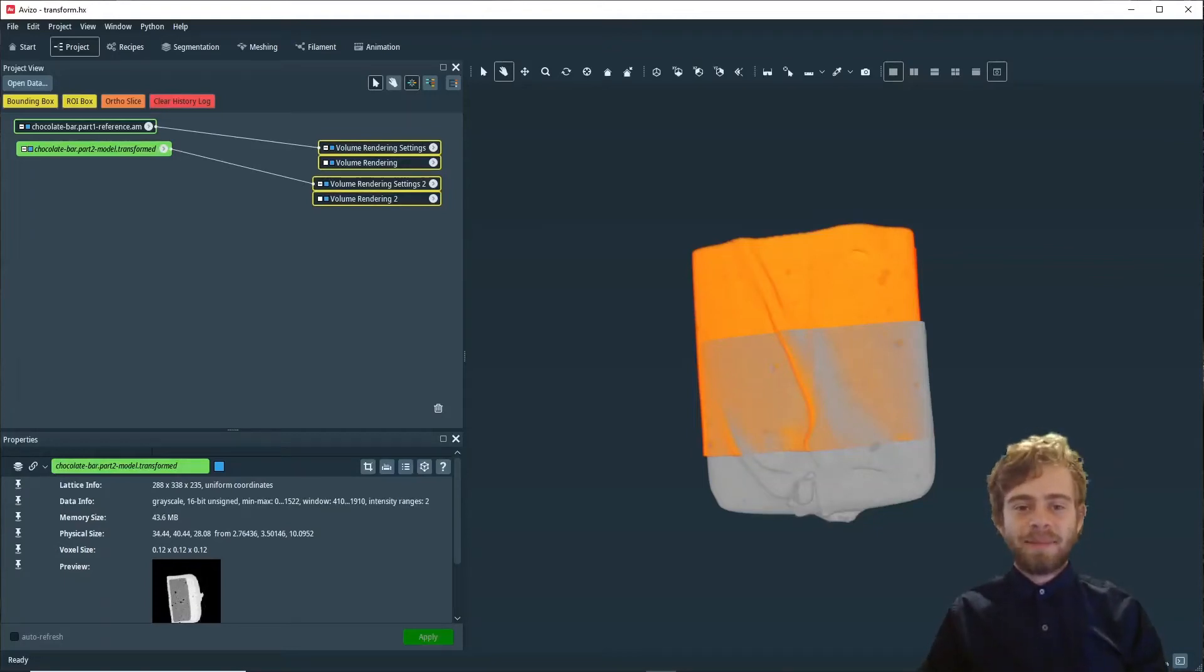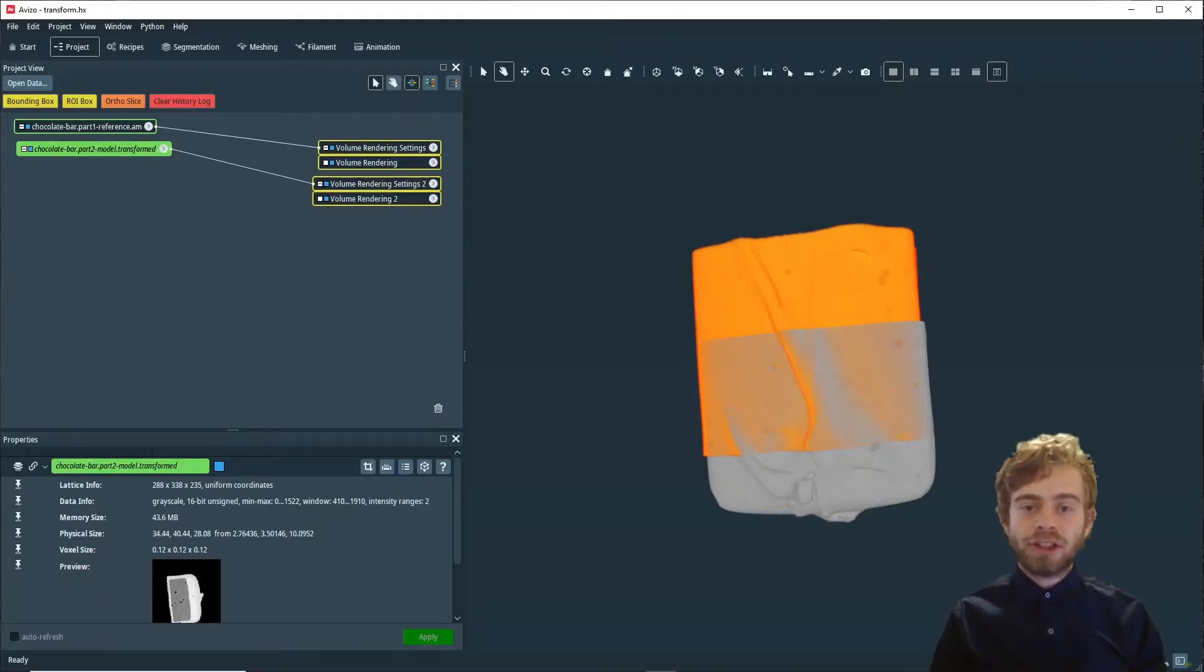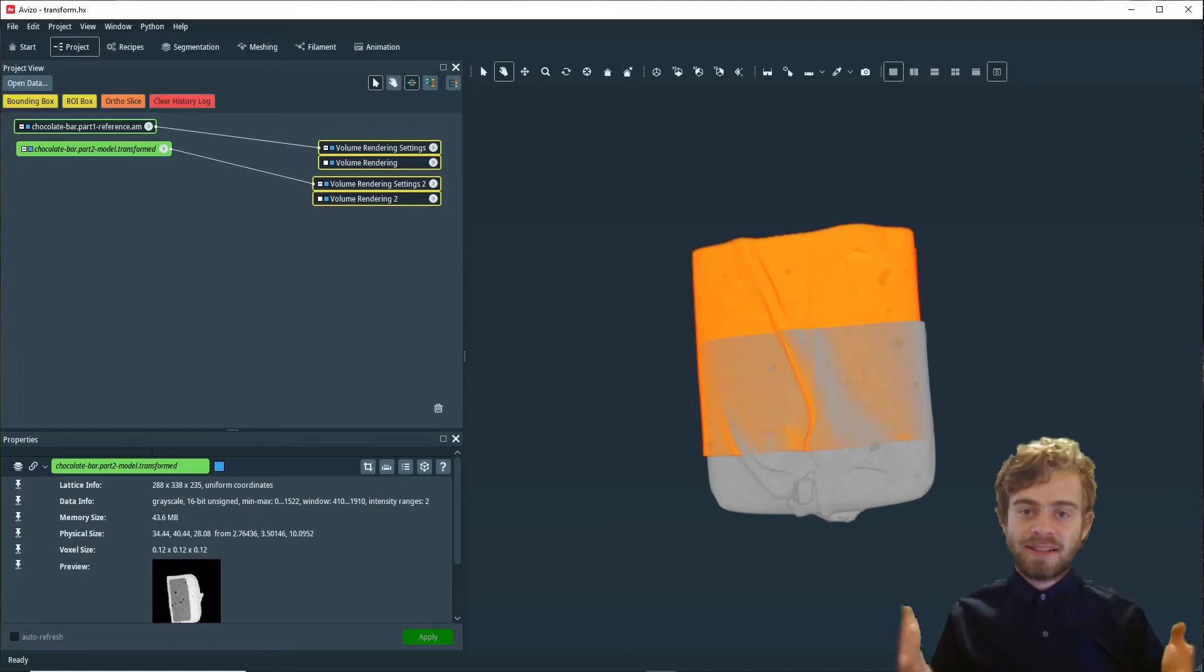Hi, my name is Sam, and today we're going to go over how to register and merge two different datasets together.